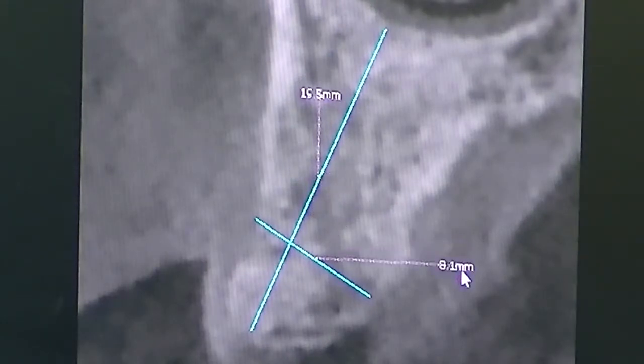As we discussed throughout the course, we have about 8 millimeters of precise horizontal bone available. And because we have a bicuspid area, we are going to place an implant about half the diameter of the tooth we want.